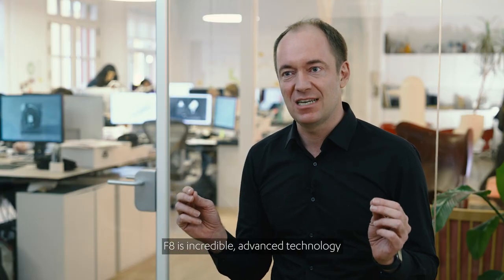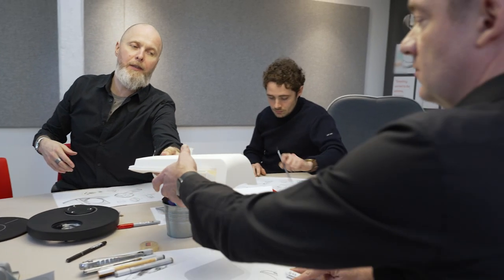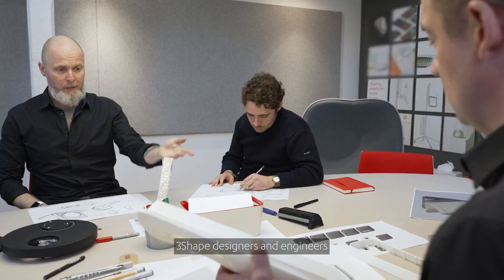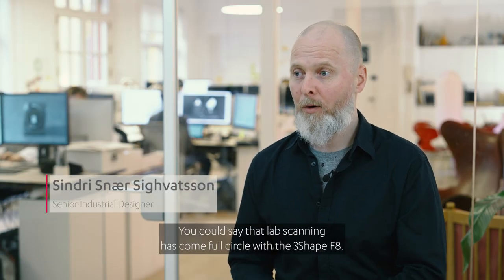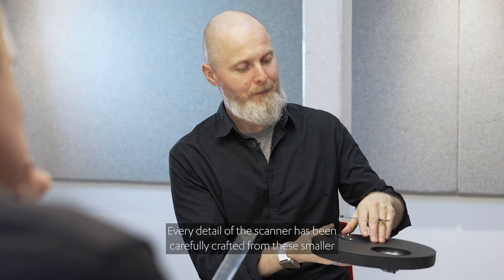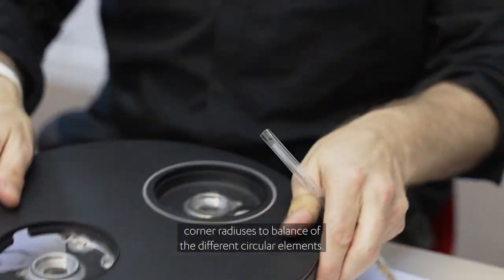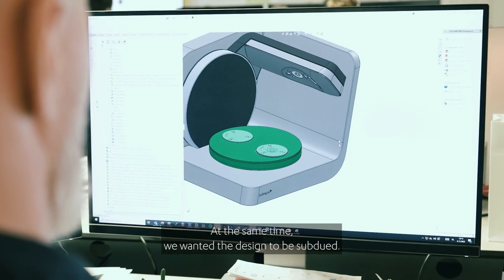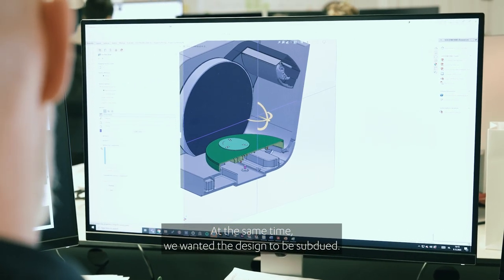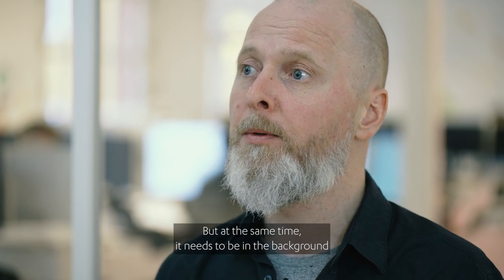F8 is incredibly advanced technology designed to be easy, quick and intuitive to use. 3Shape designers and engineers took the challenges and turned them into solutions. You could say that lab scanning has come full circle with the 3Shape F8. Every detail of the scanner has been carefully crafted, from the smallest corner radiuses to the balance of the different circular elements. Asymmetry gives motion to F8 and helps improve workflow speed. At the same time, we wanted the design to be subdued, because we believe that technology should of course be beautiful, but at the same time it needs to be in the background.